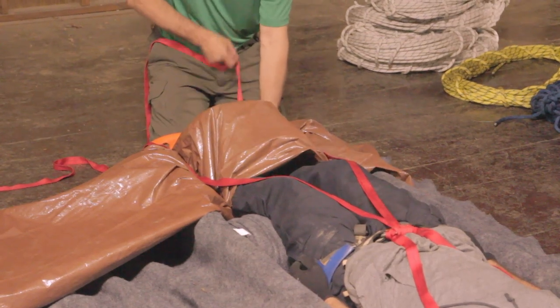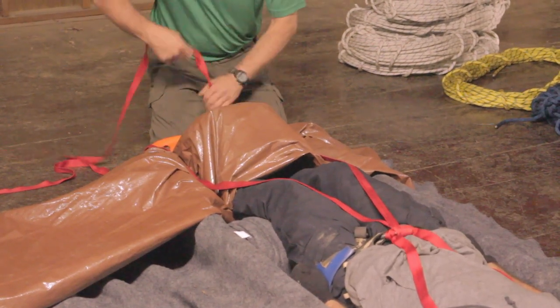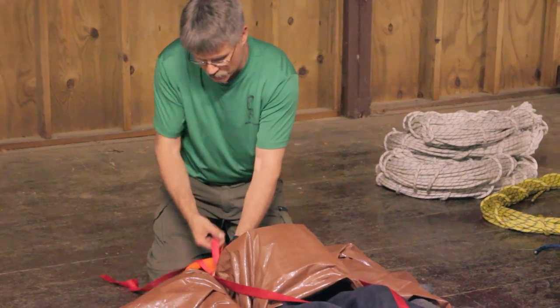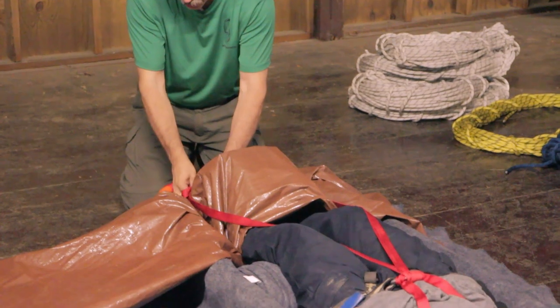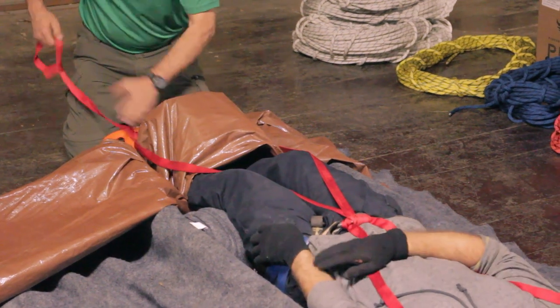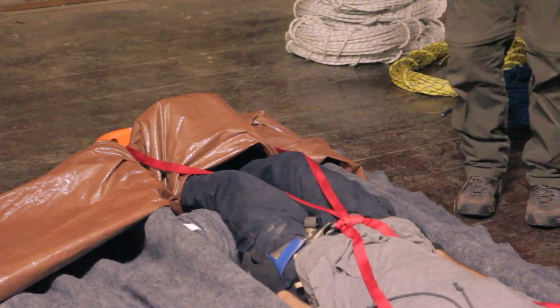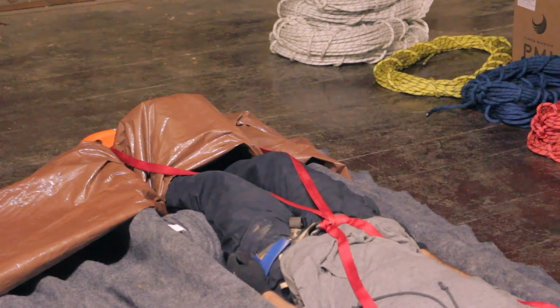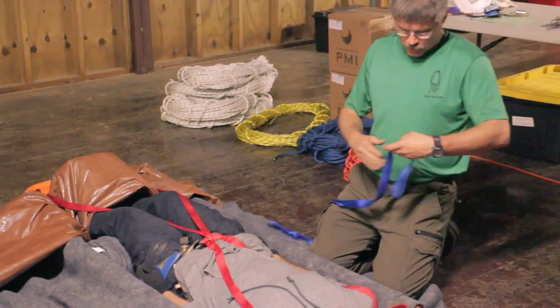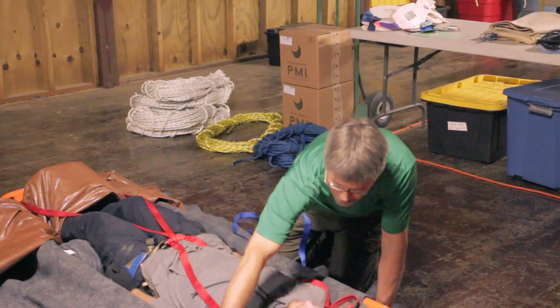Note that I am not rigging into the rails — the handholds of the litter — so we want those available for their intended purpose. We've got three half hitches, or a half hitch followed by an overhand. These bottom ones I'm just barely taking the tension out of; I don't want to pull the seat harness D-link so that it becomes upright and causes any pressure against his groin area. So now we have the double Vs in place so that he can't slide either direction. What we want to do now is attach a tether that we can extend from the patient so that whenever we're using rigging, that rigging can have a direct connection into his harness.